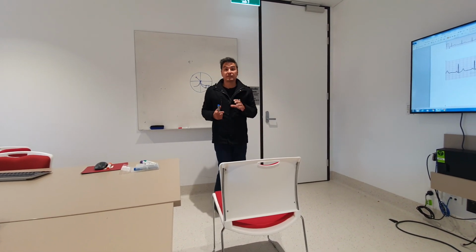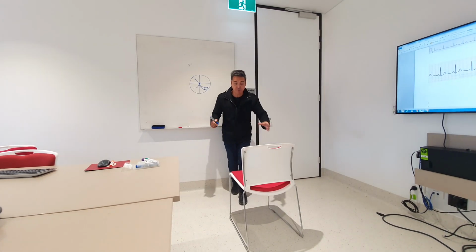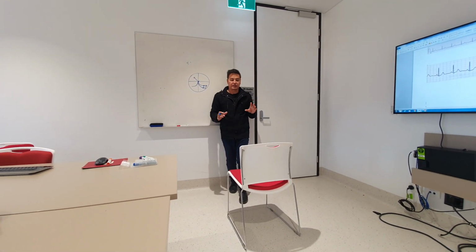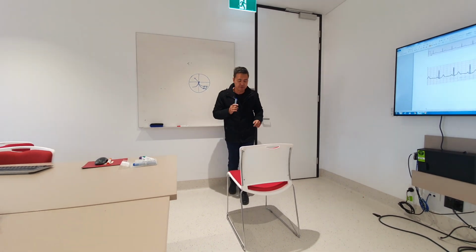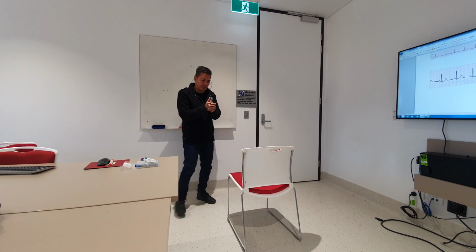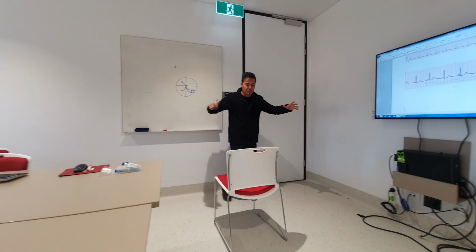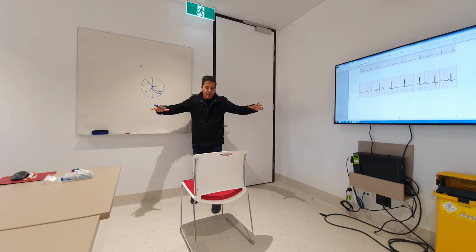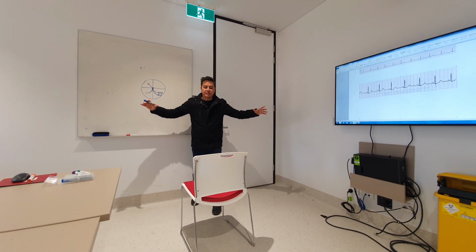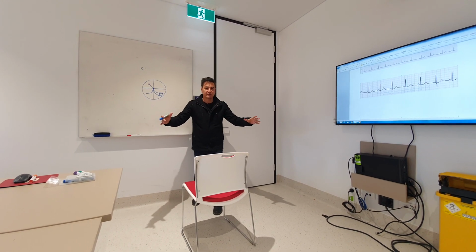But when we do a 12-lead ECG, this is what we're actually doing. So what we're doing with normal ECGs, we're putting 3 leads, but with a 12-lead ECG, this is what we're doing. We're putting one camera here, and we're putting another camera here, and we're doing that around the heart, right? So we're putting all these different cameras around the heart, and then it's kind of like we're pressing record, and we're going to record how the heart's moving from these different angles.